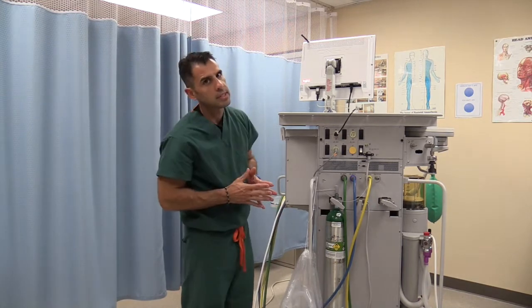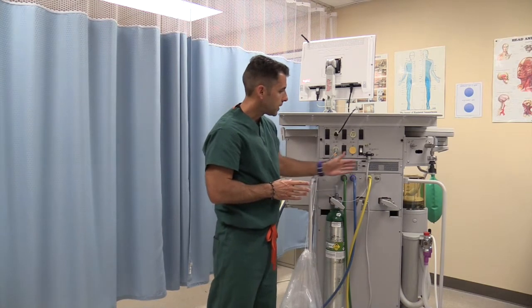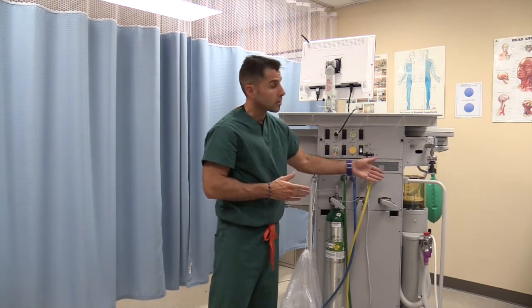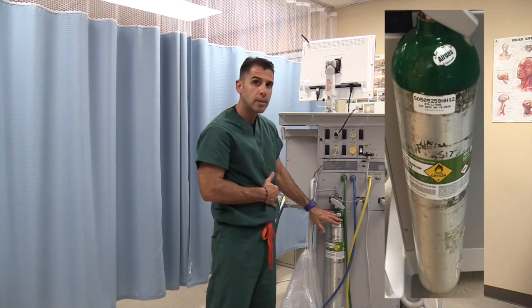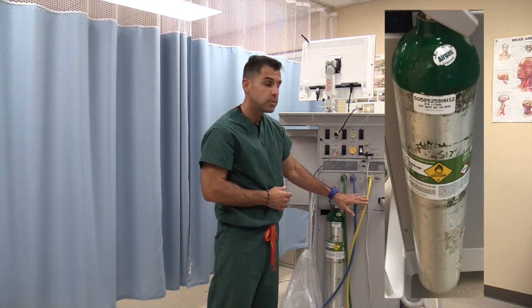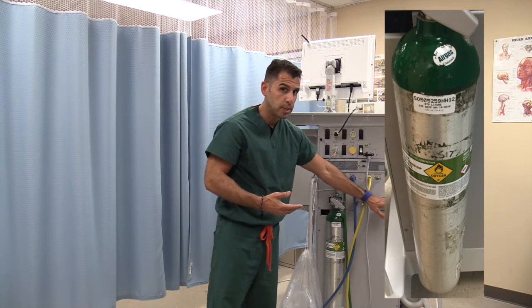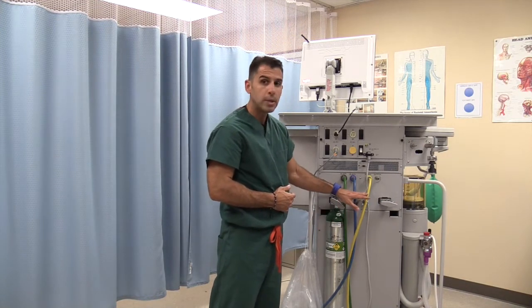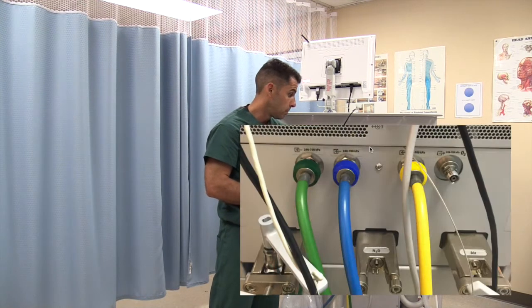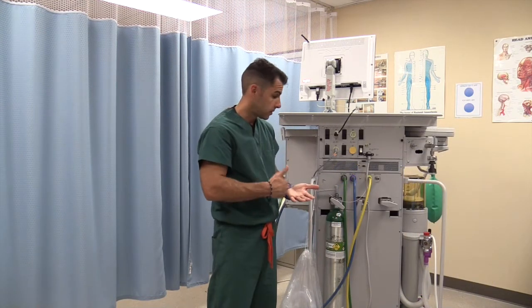In keeping with the pin index safety system, in the back of the anesthesia machine you will find inlets for each one of your tanks. You will have a green tank for oxygen, a blue tank for nitrous oxide, and a yellow tank for air. You cannot connect a green tank to a blue inlet, and you cannot connect a blue tank to a yellow inlet, because they are reserved for air and nitrous oxide.